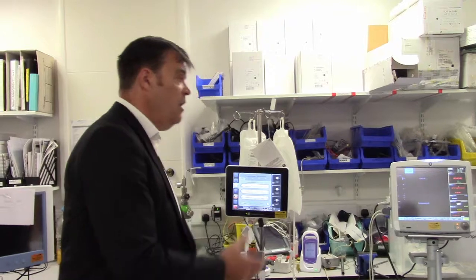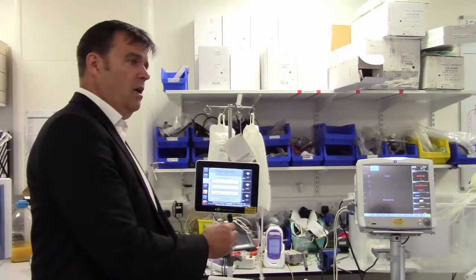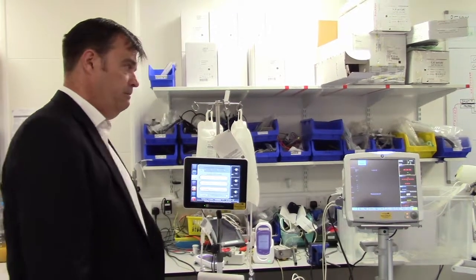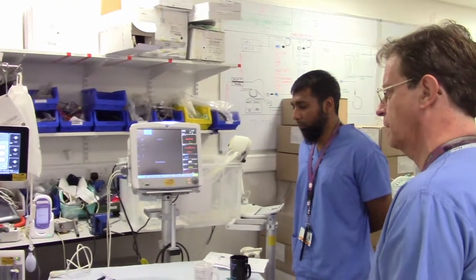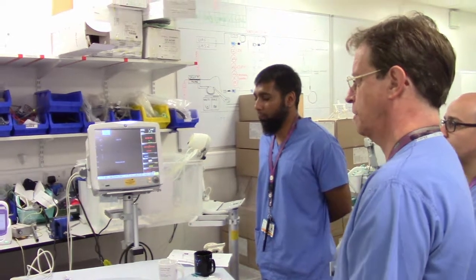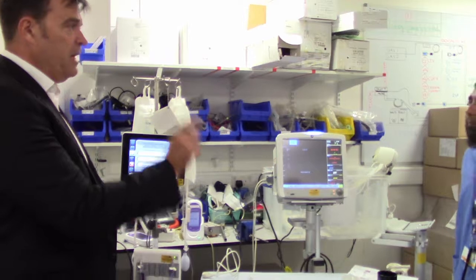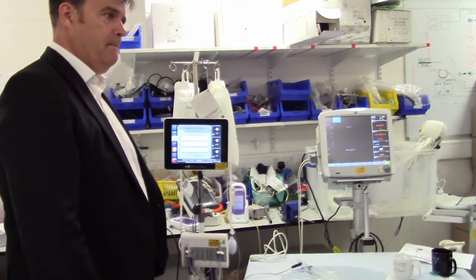You could even try 10 first, because it's only saline that you're giving, so there's no risk with trying a smaller volume if you want to. If you tried a 10 on the first injection, thought actually that's not very good, and upped it to 15, presumably you have to go back and tell it that's 15. Yeah, absolutely, because the volume is dependent on the calculation as well.